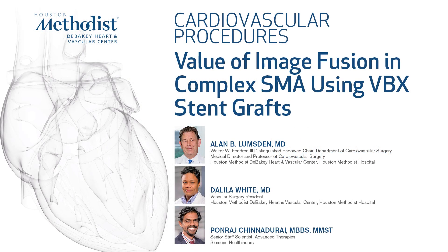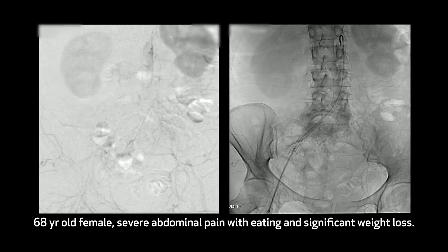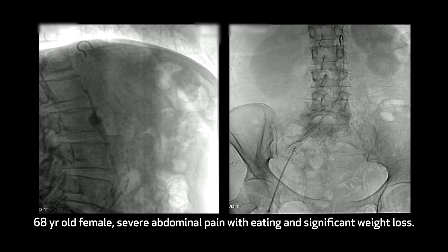This is a 68-year-old female presenting with severe abdominal pain when eating and significant weight loss. The pre-op CT scan, which we'll show a little bit later, showed extensive SMA disease.